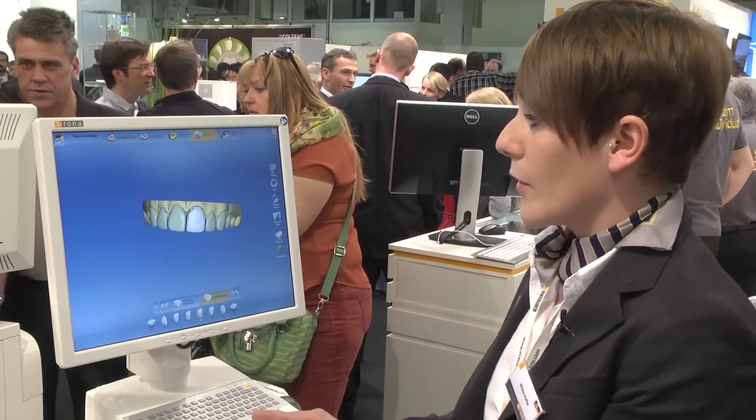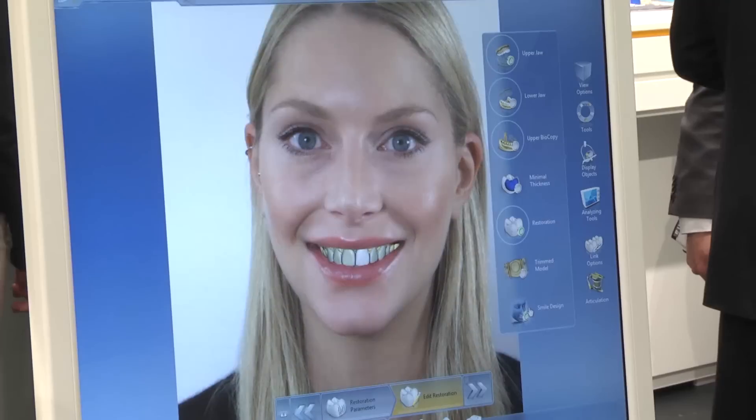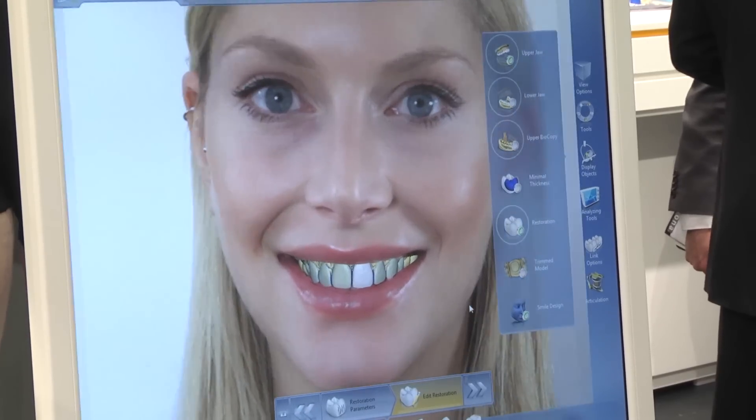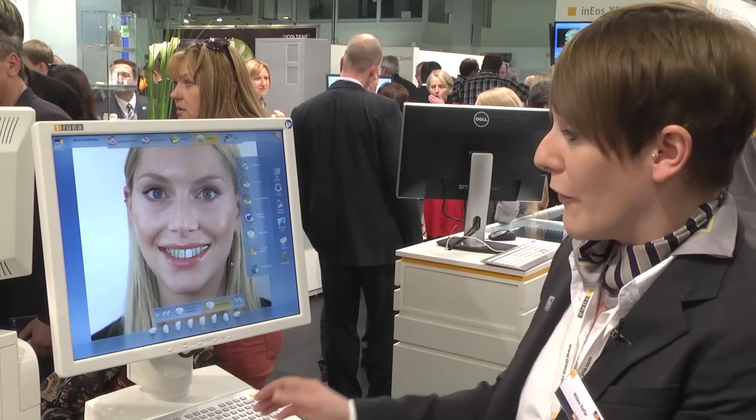Now I'd like to show you the second advantage of the new CEREC software 4.2 — the so-called smile design. Here you see a large case with lots of restorations on the front, including some veneers. For the smile design you need a photo of your patient with a smiling face. You display the options, select smile design, and you can directly see the picture of the patient, position and edit all the restorations you'd like to change, and align them to the lower lip, which is very important for the final restoration.